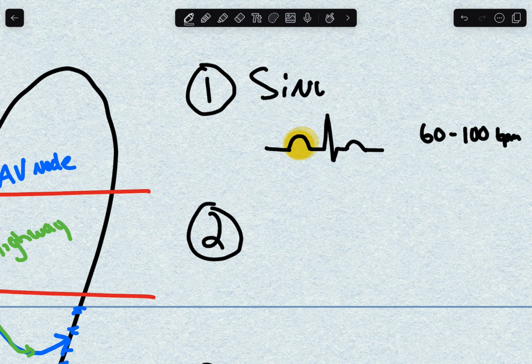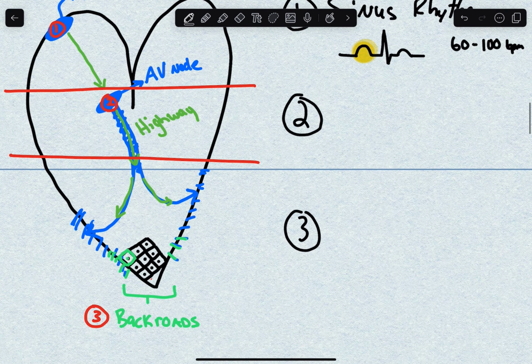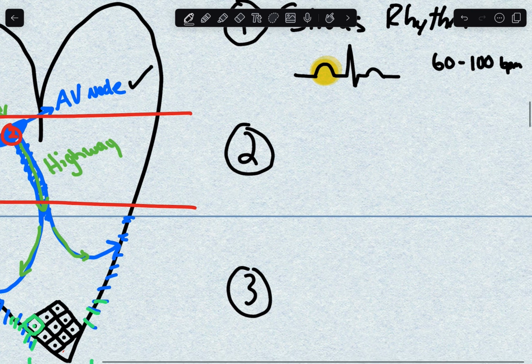For there to be a sinus rhythm, there needs to be, again, an upright P wave that is round with a normal PR interval that precedes every QRS complex. The next area, which originates around the AV node and in the interventricular bundle, is denoted by the lack of a P wave, but still having a narrow QRS complex.